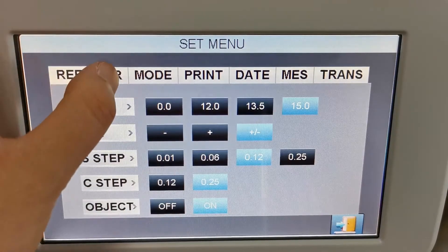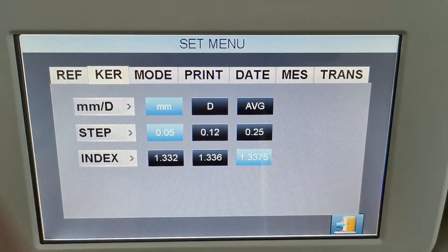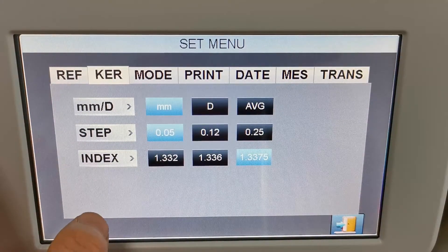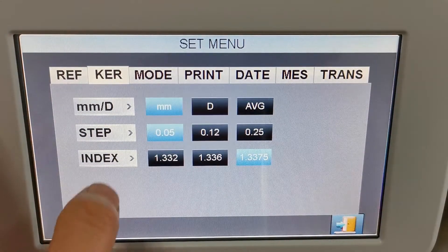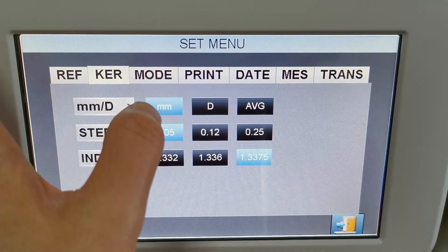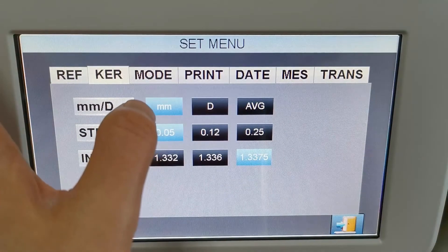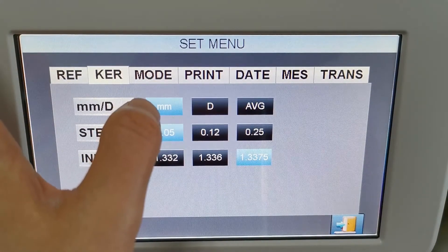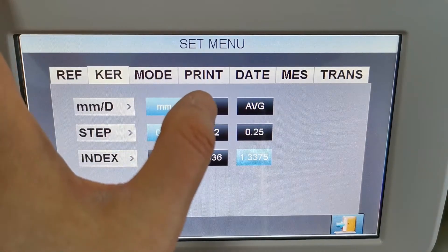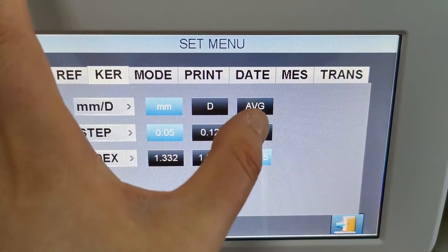Here is the keratometer function parameters. Here is the measurement unit — you can set it to millimeters, diopters, or average.